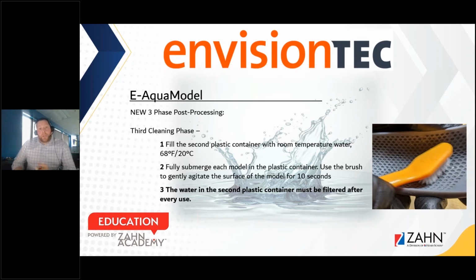The first part was just the initial bath to get the full bulk and give a rough cleaning of the units inside a lukewarm or room temperature bath. Then we did the second part, which was bringing it into the ultrasonic at a much higher temperature, because we need to make sure we're dissolving the resins on the actual model itself.